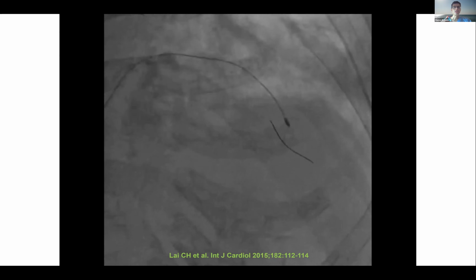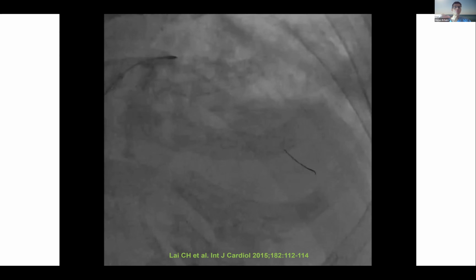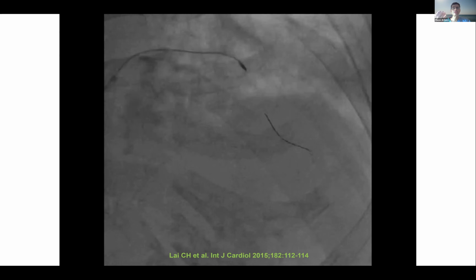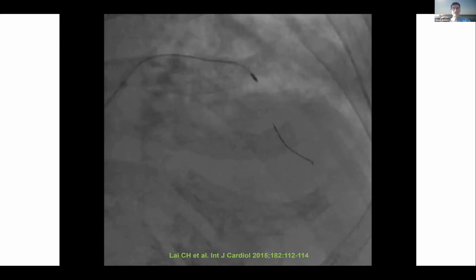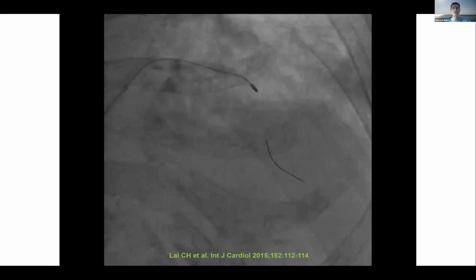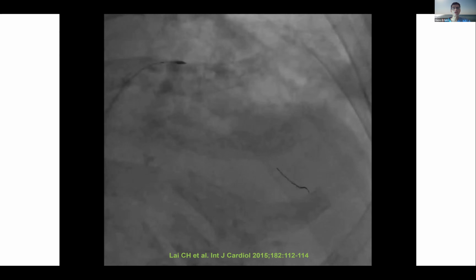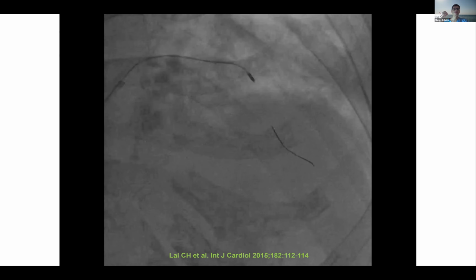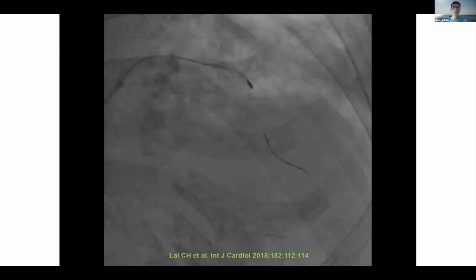One is the risk of causing embolization because you're stopping the blood flow. The other is you may get the burr stuck. The third is that here it looks like there was a bend, and by keeping on doing that, I think probably what happened is the wire kinked, and then the burr went out.